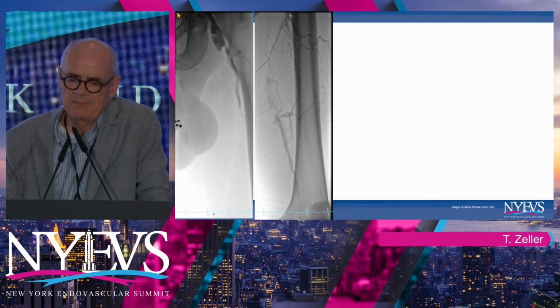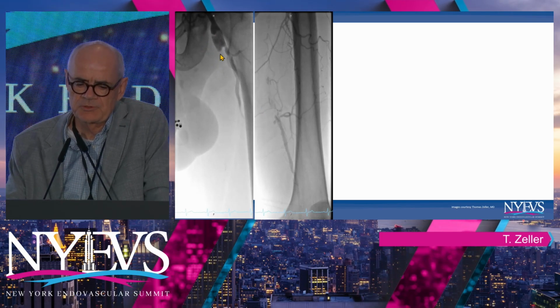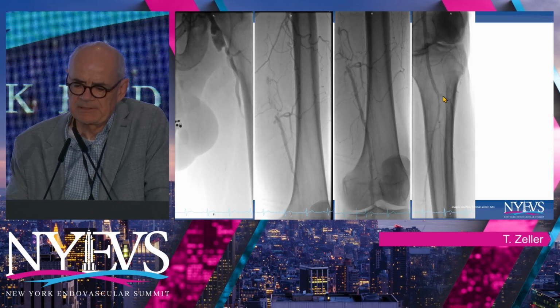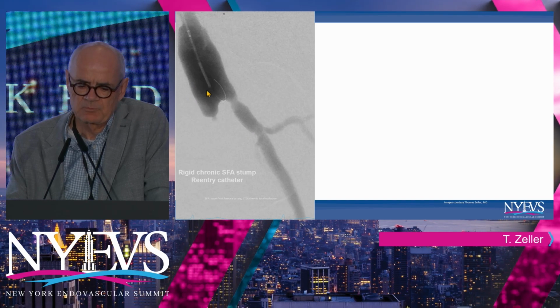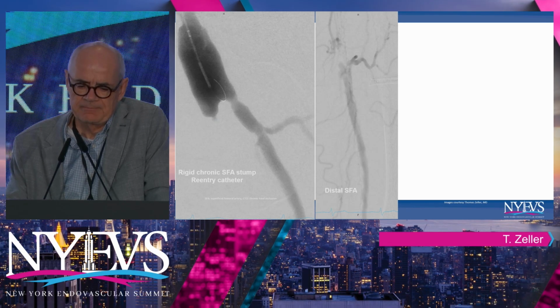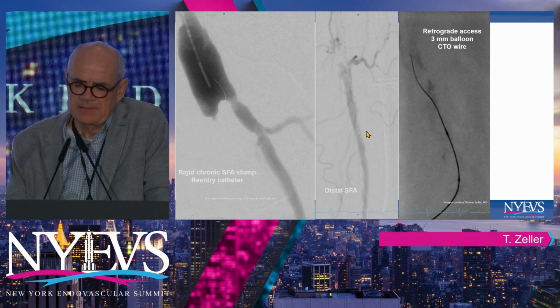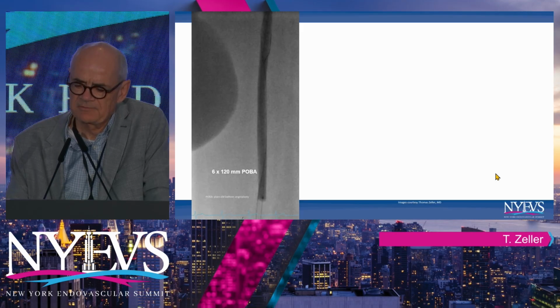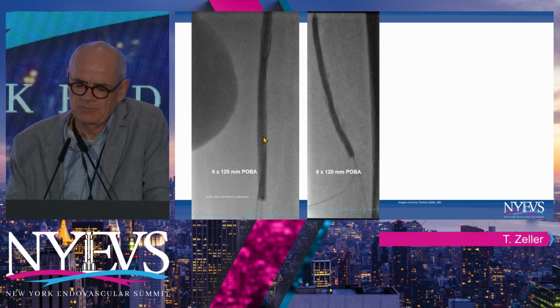You can see here a patient after thromboendarterectomy of the common femoral artery on the left side, with a total occlusion beginning at the origin of the SFA and reconstitution in the distal SFA segment. So here, even with a re-entry system, with a needle system, it was impossible to directly enter the intraluminal segment, so the wire went subintimal initially. Retrograde access was used. You can see here it's a kind of CART technique. It's a rendezvous technique using retrograde and antegrade access.